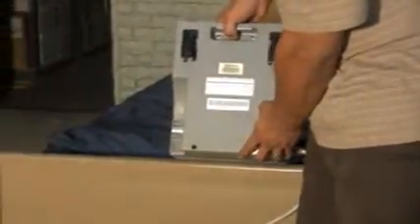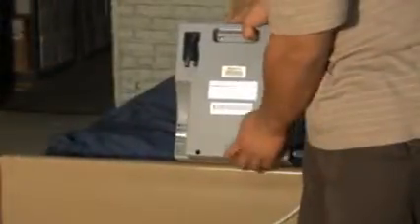Once your power has been turned off and your hose has been disconnected, you may raise the air unit from your footboard and turn that around. On the bottom side of your air tube connection, there is an air filter location. Simply pull and remove this air filter out as such.